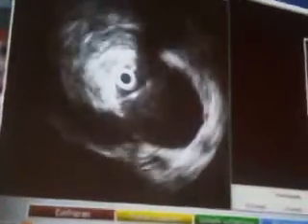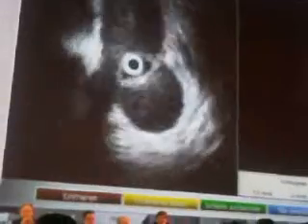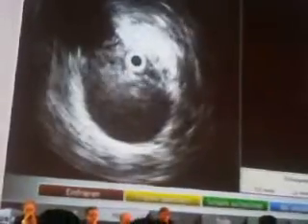I would go further down here again, a very narrow lumen in the abdominal aorta. When I go into the common iliac artery on the right side, you can see this very narrow, collapsed true lumen, and this fits to the claudication which this patient now feels. Fine, so we are absolutely right with the wire.